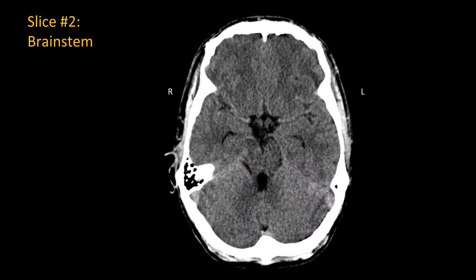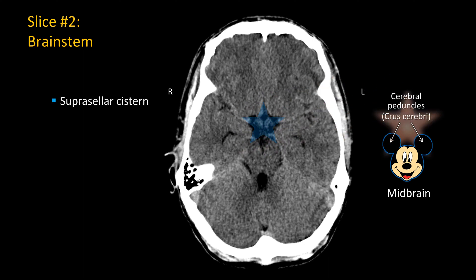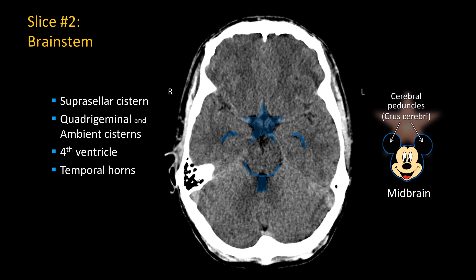One level above at the brainstem, specifically at the level of the midbrain, the midbrain on axial view looks like a Mickey Mouse, and the ear of the Mickey Mouse is the crus cerebri or cerebral peduncle. Anterior to the midbrain, you will see a very important star-shaped cistern — the suprasellar cistern — which you want to make sure is widely patent. Posterior to the midbrain, you should see the smile-shaped quadrigeminal cistern and ambient cisterns. The quadrigeminal plate cistern is the flat portion; the corners of the smile are the ambient cisterns. Make sure they are open and not compressed. To the side, in the medial portion of the temporal lobe, you should see small temporal horns — the most dependent portion of the lateral ventricle — and make sure they are symmetric and not dilated.